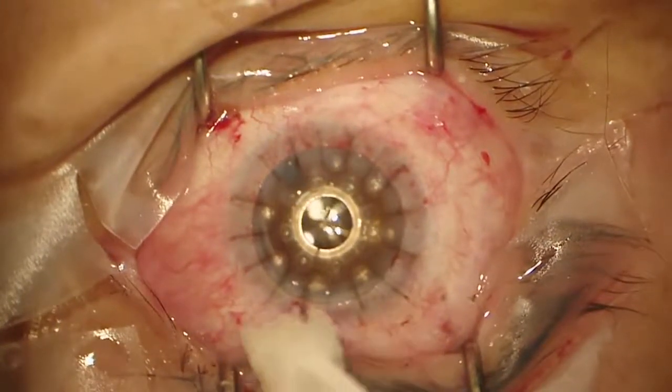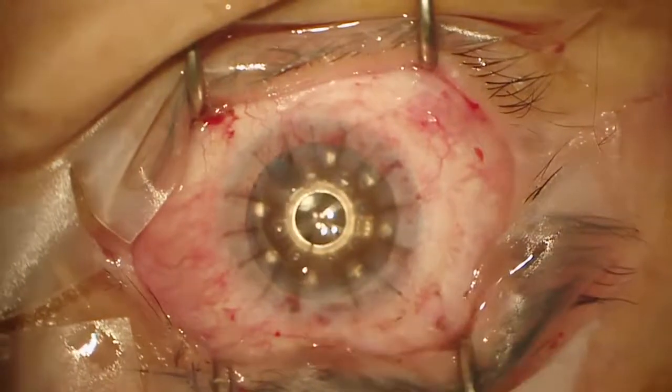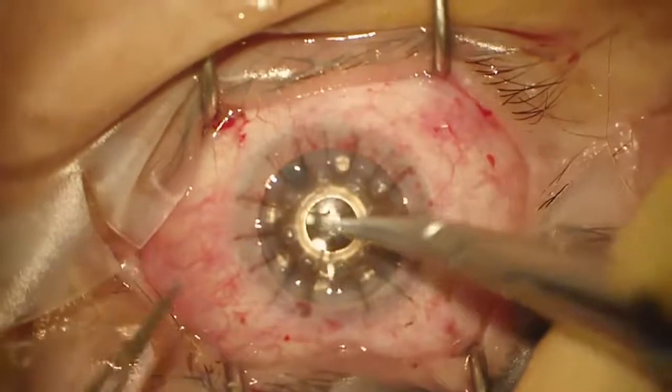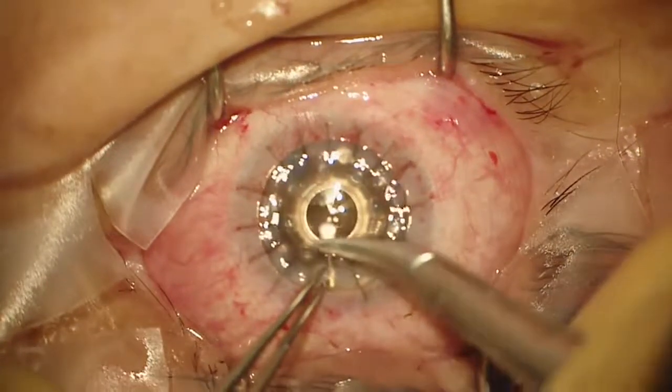I think maybe that one needs to be replaced. I need one right-handed stitch, please. She will be able to see tomorrow. You'll see, it's pretty amazing, actually.